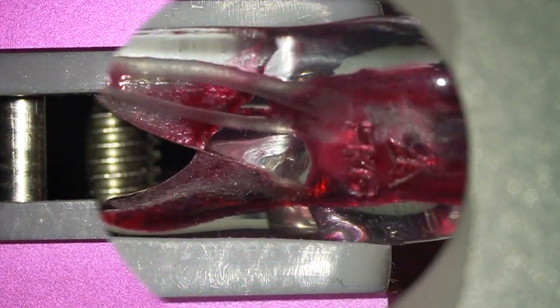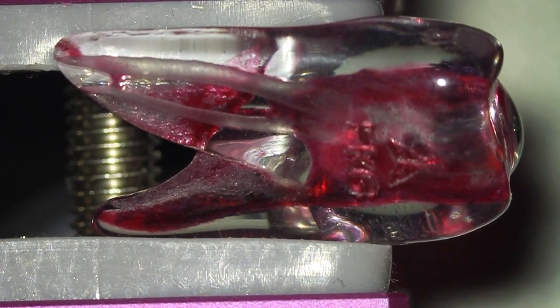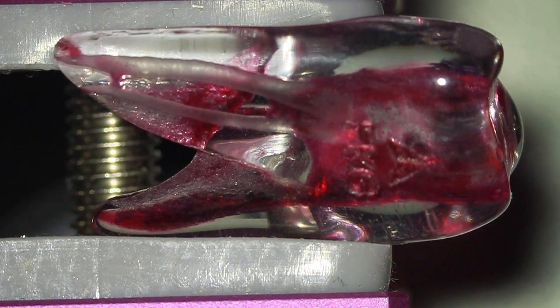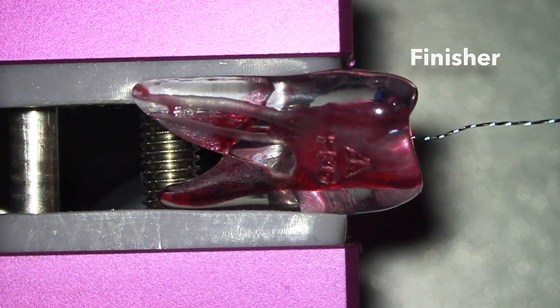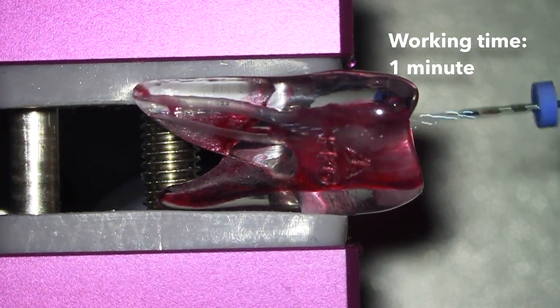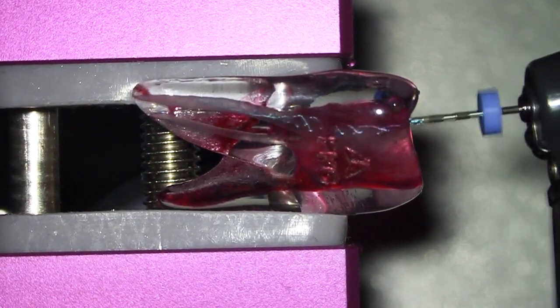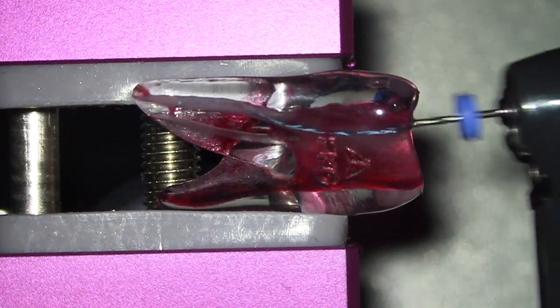Let's have a closer look at the root canal system that we just instrumented. The space is nicely shaped, but it is not clean enough to proceed to obturation. That is why we will use the finisher. Insert the file pointing towards the cusp and start the motor. Use long gentle strokes of 7-8 mm for 1 minute to clean the entire canal adequately.